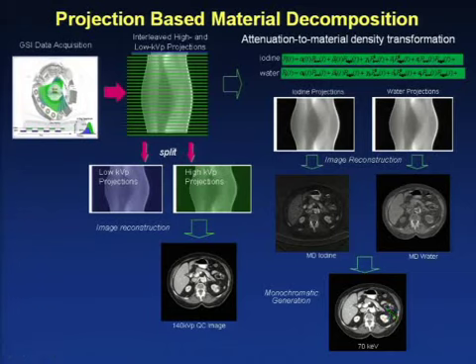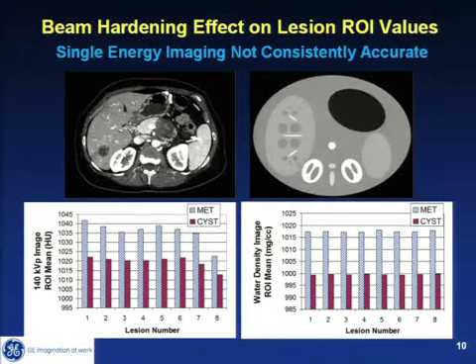So from this graph, I hope you'll get the impression that previously, for a CT scan, after one scan, you generate one set of images. Now, this is no longer the case. You suddenly get a variety of different images, and here we only show you one material pair. You have many, many different material pairs depending on the clinical application at hand. Also, for these monochromatic images, you have many different energy levels you can generate. So we are no longer just generating anatomical information, but now you start getting into the material characteristic portion of the study. So what is the advantage of dual energy CT?